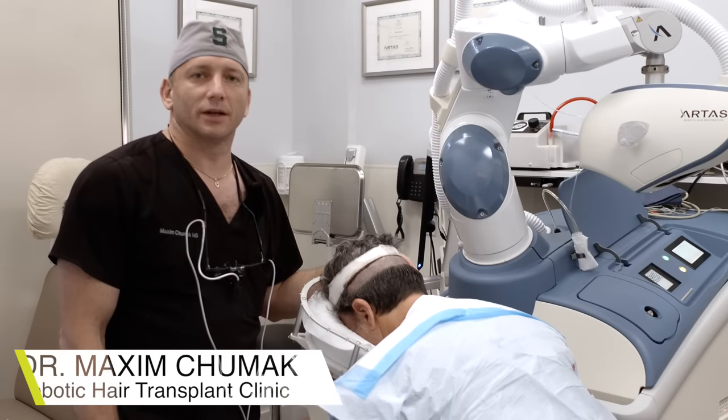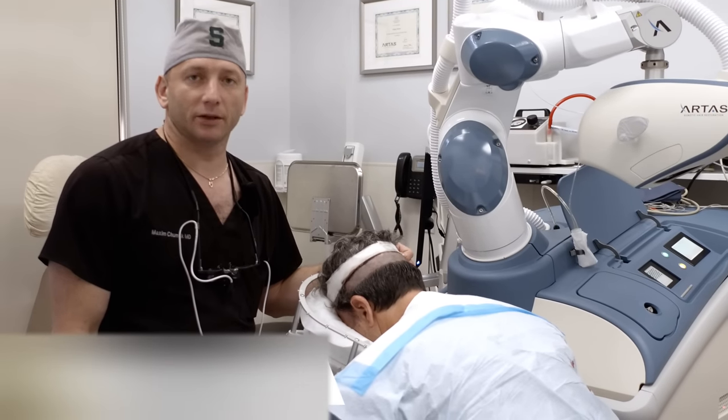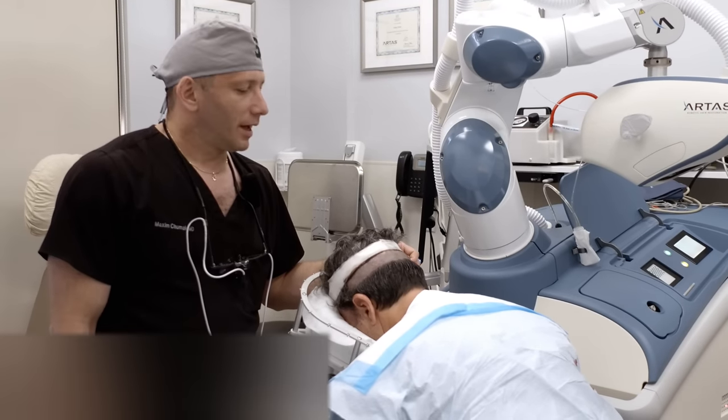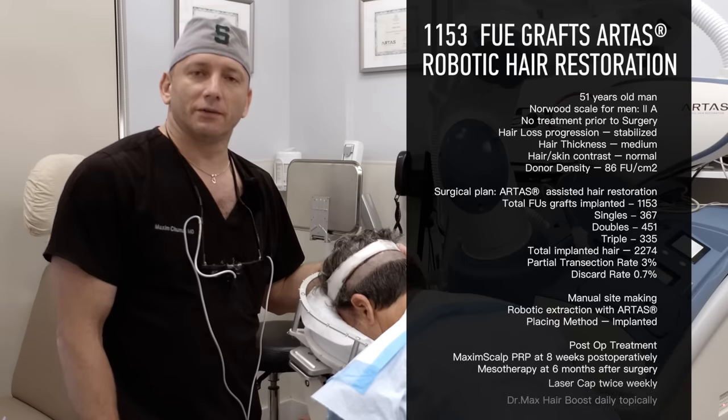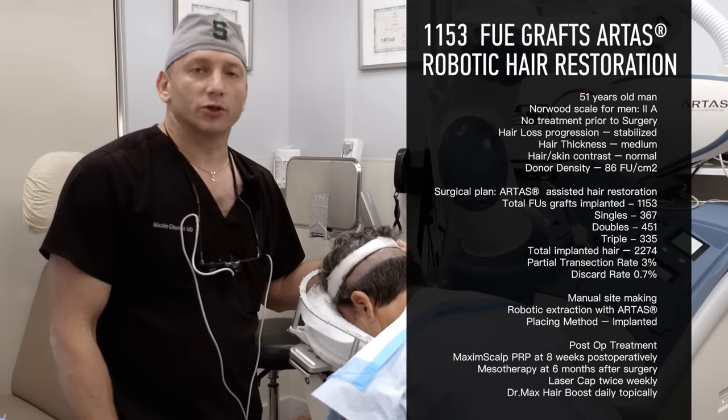Good morning, I'm Dr. Max here at Maxim Medical Robotic Hair Transplant Clinic in Fort Lauderdale, Florida. We're here to begin a 1100 graft robotic hair restoration procedure.